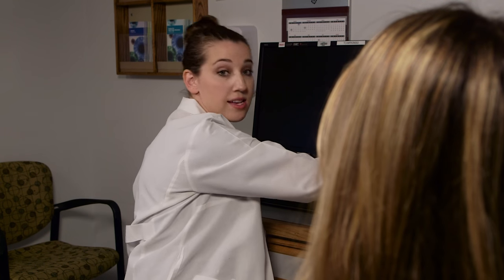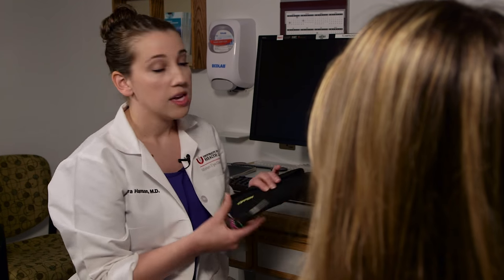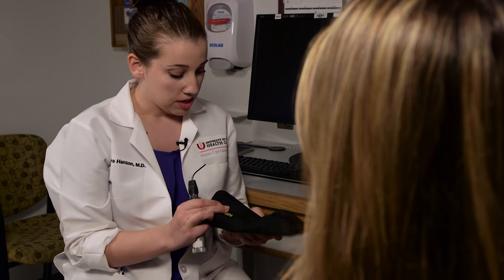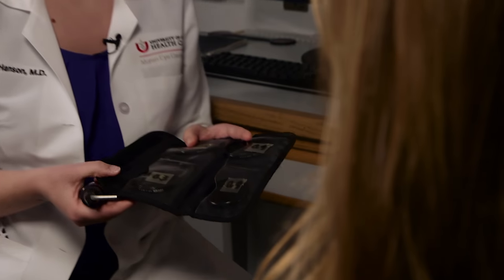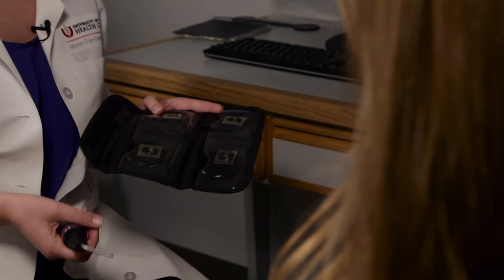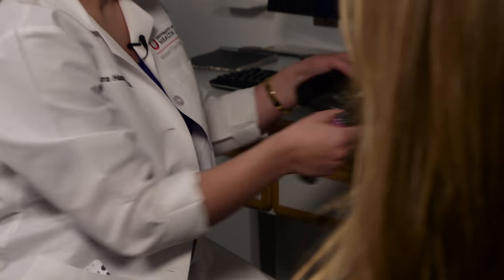Now we're going to be testing for an afferent pupillary defect and we'll talk about how to measure the size of the defect. All you need is a muscle light and some neutral density filters. The ones we have here are in 0.3 log unit increments — we have a 0.3, 0.6, and 0.9.